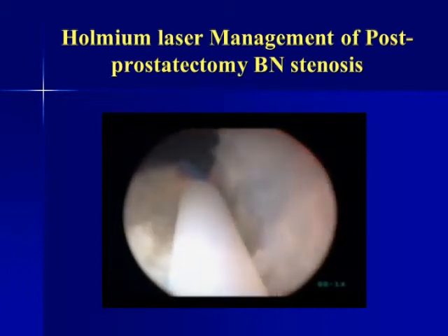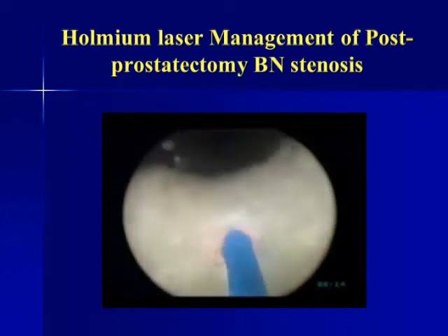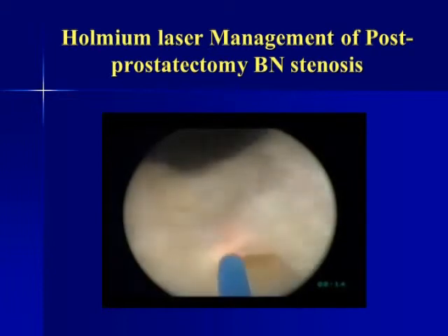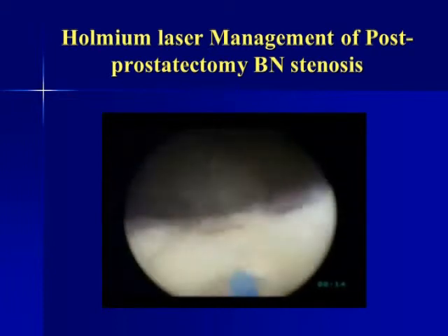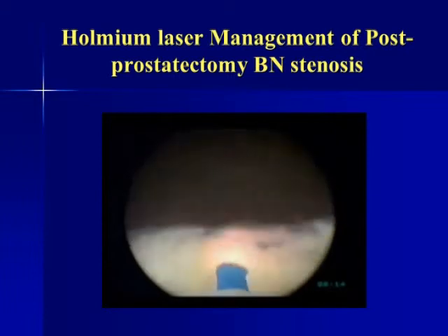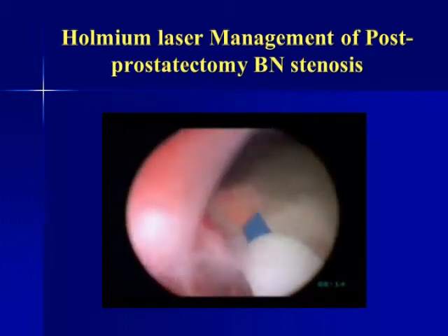The advantage of laser over cold knife is that we can resect that fibrous tissue and keep supple tissue behind, so that the chances of restenosis probably will be less, although there is no head-to-head comparison. But in my personal experience, we have not seen any patients coming back for restenosis. No patients need dilatation or calibration, at least after bladder neck surgery. They do need it after a stricture urethra surgery.